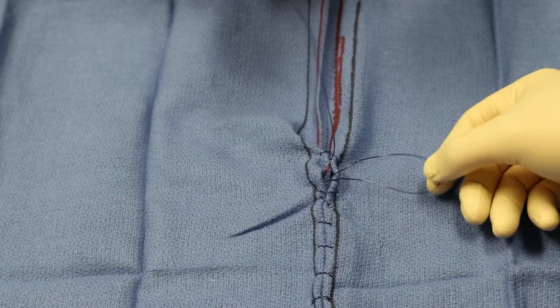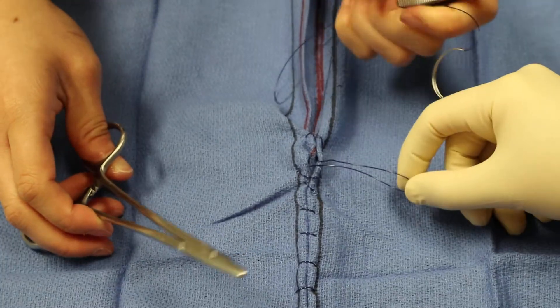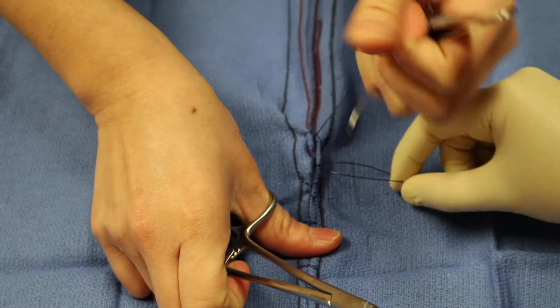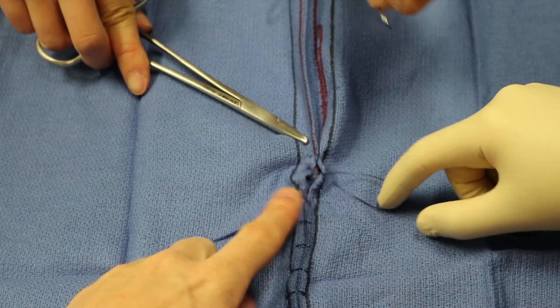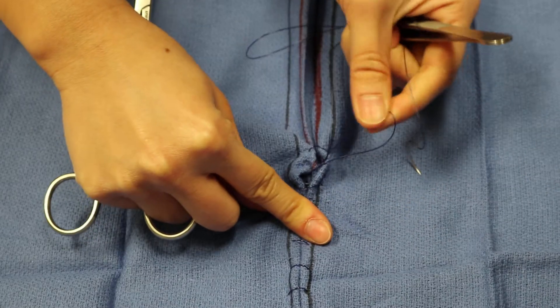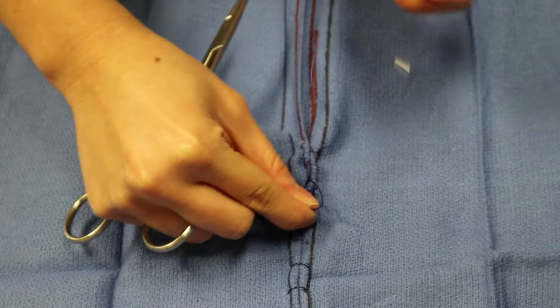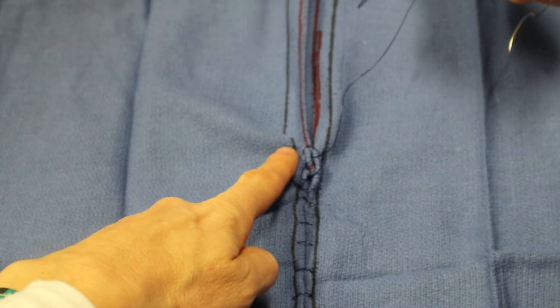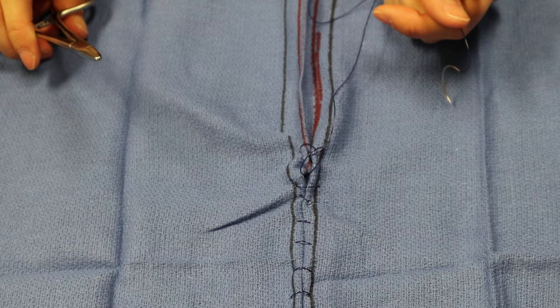Before we tie that, we are just going to check and make sure that our deep loop and our deep leg are inside of that little suture box that we had. So we're not going to tie over this one right here or that one there. We have a loop and a leg that are together and they're not going to be tied over anything. When you're building this deep loop, you want to make sure the bites out here — that deep to superficial, superficial to deep — are wide because then it helps you to make a deeper pocket since there's no incision anymore.